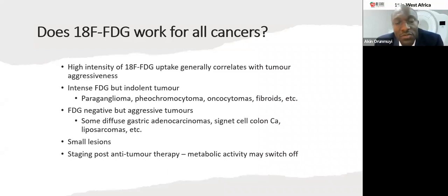It's also very useful for staging after treatment. But if a patient has had recent chemo, there might be a temporary switch off of metabolic activity. So we always want to know the history so that we can suspect if there's a switch off or if it's truly a metabolic response to treatment. Next slide, please.